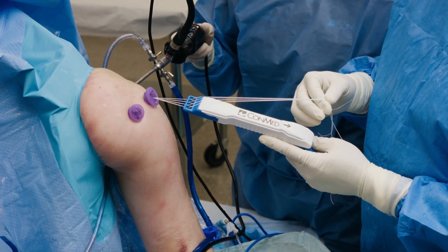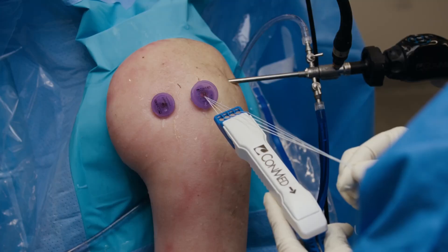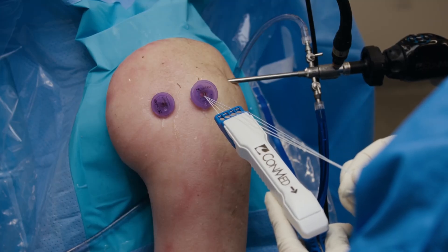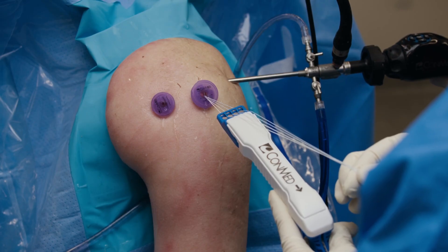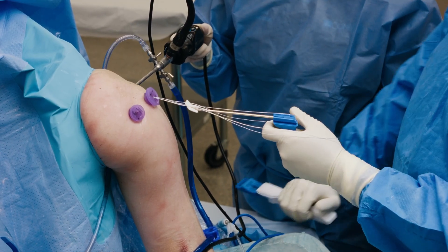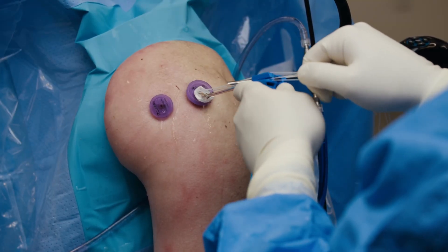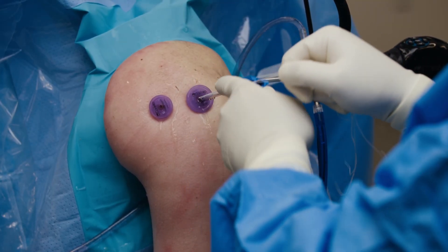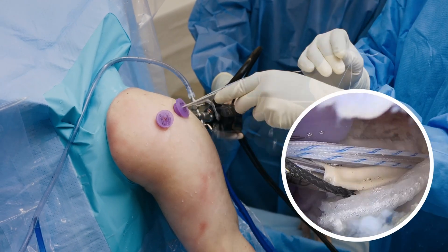The biobrace RC makes suture passage extremely convenient and efficient for the surgeon. To do this procedure, we're going to make sure that all of the sutures have been appropriately loaded in the corresponding hole. Then we'll look at the black arrow on the back of the handle, pull that back, up, and away. In that process, all of those sutures are conveniently passed through the biobrace device, and we're quickly ready to deploy that through the hydroseal cannula and into the rotator cuff repair construct.